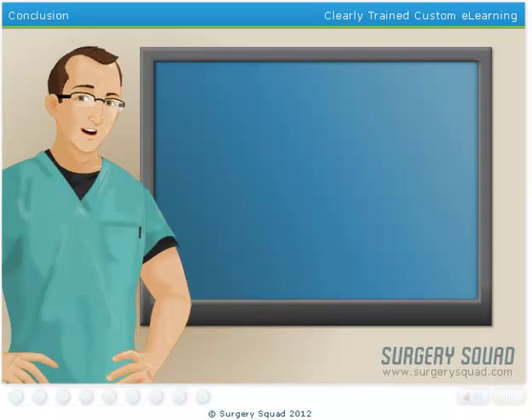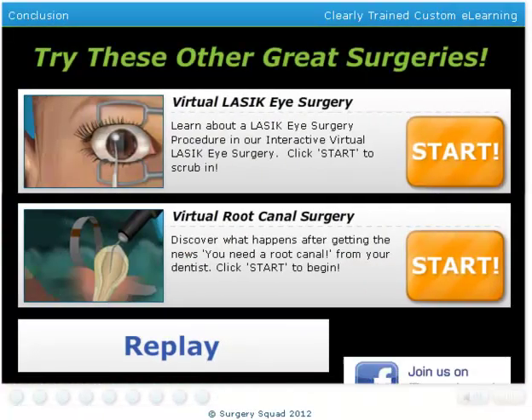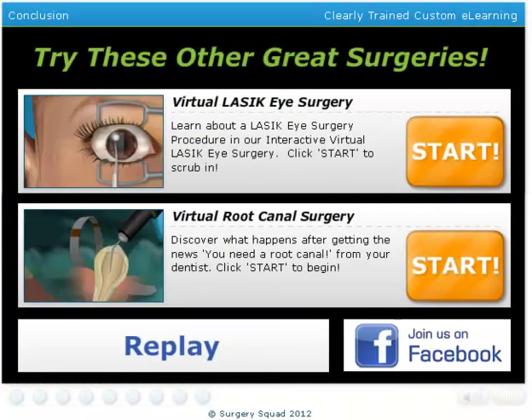And that's a dental filling. You've done a wonderful job. You may want to go back and try out the other type of filling, or why not try your skills in another surgery?